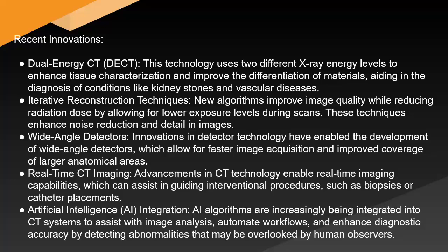Recent innovations. Dual energy CT (DECT): this technology uses two different X-ray energy levels to enhance tissue characterization and improve the differentiation of materials, aiding in the diagnosis of conditions like kidney stones and vascular diseases. Iterative reconstruction techniques: new algorithms improve image quality while reducing radiation dose by allowing for lower exposure levels during scans. These techniques enhance noise reduction and detail in images.